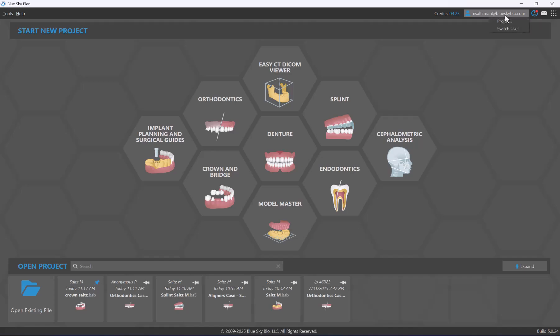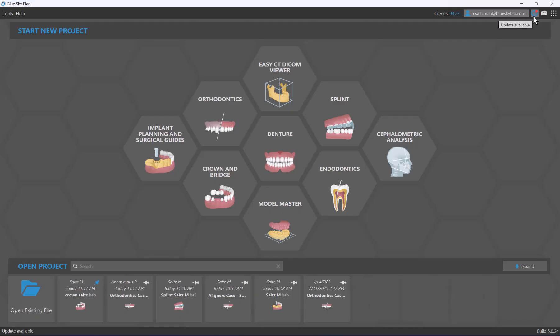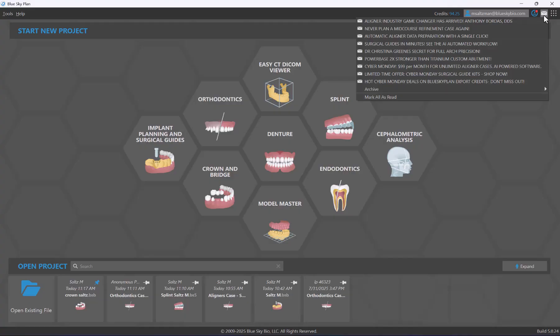We have the email address of the user currently signed into Blue Sky Plan — the export credits and patients are associated with that particular user. You can switch users by clicking the switch user option, or access your profile by clicking on profile. To the right, there's an indicator if a new version of Blue Sky Plan or new parts catalogs are available to download and update.